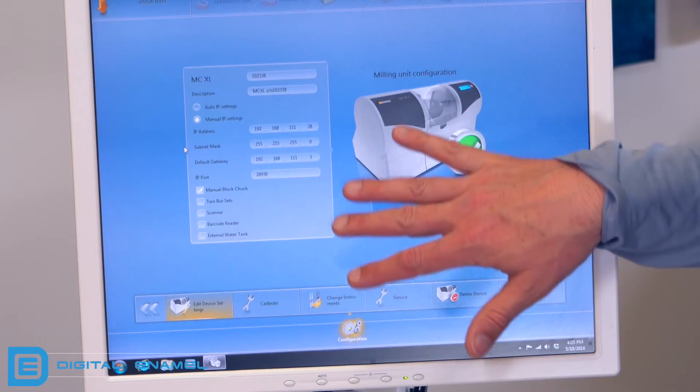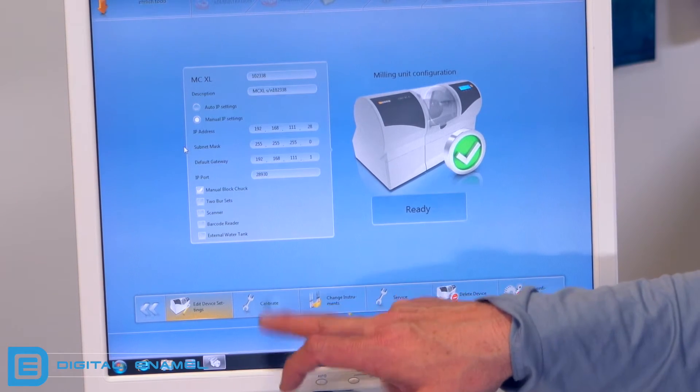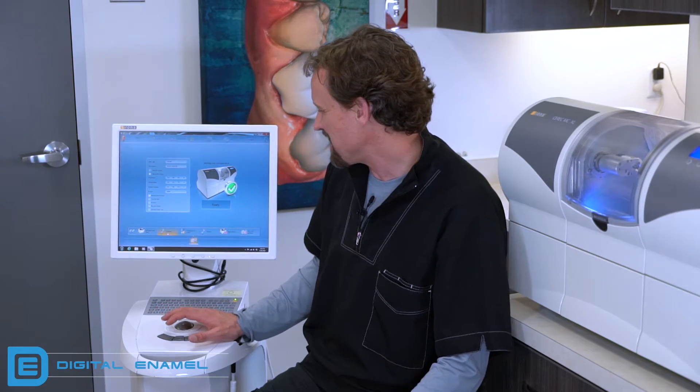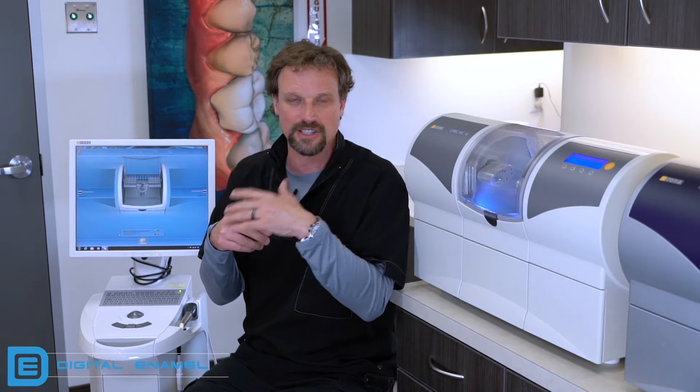I'm going to select this milling chamber. In this window you're going to see all sorts of things with the IP address and different selections, but we're going to go down to where it says calibrate — you'll see a little wrench down here. Select that. When you immediately hit that button, the motors come into position, but if the door was open it wouldn't allow it to happen, and then you'd have to go all the way back to your milling chamber and shut the door.